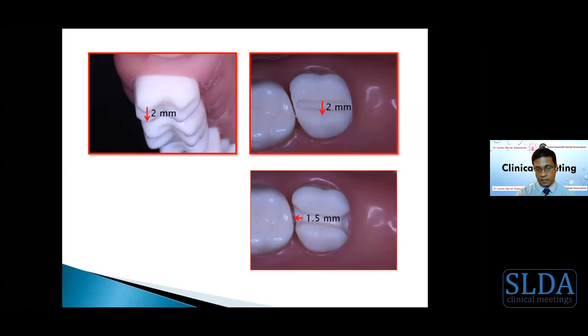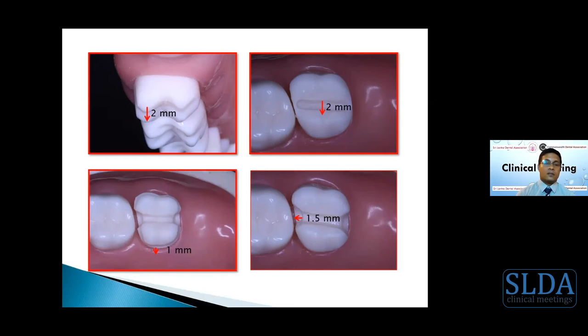And you can clearly see here, there's a gap between the tooth preparation and the adjacent tooth. It is because we have gone past the proximal contact. That is better, because now your technician can sculpt your indirect restoration with good proximal contacts and a good shape and contour. Then you should prepare the shoulder margins, both buccal and lingual aspects. It has to be 1 millimeter in depth again.